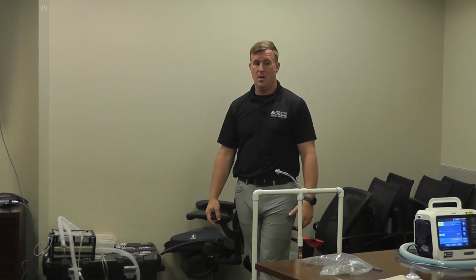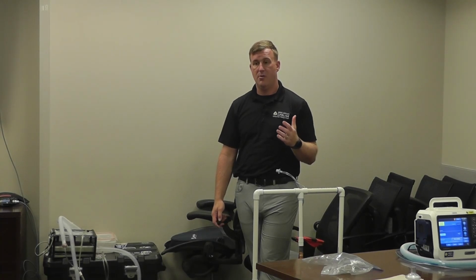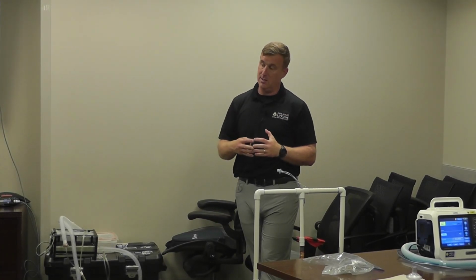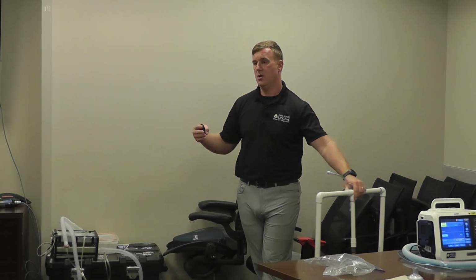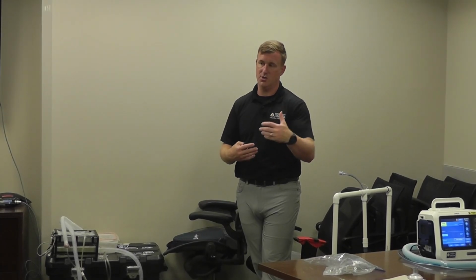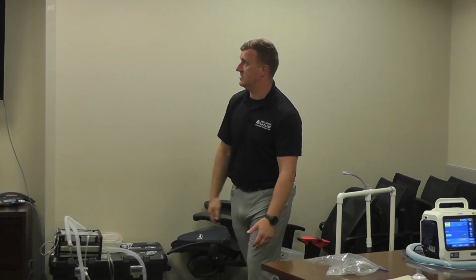Okay? There's been tons of studies. Recruitment maneuvers don't work. The reason is because we blow the lung open and then it collapses back down. The better way to do this is to recruit the lung using PEEP over an extended period of time. It's also probably a much more gentle way to recruit the lung. We're going to talk about our PEEP of best compliance study.